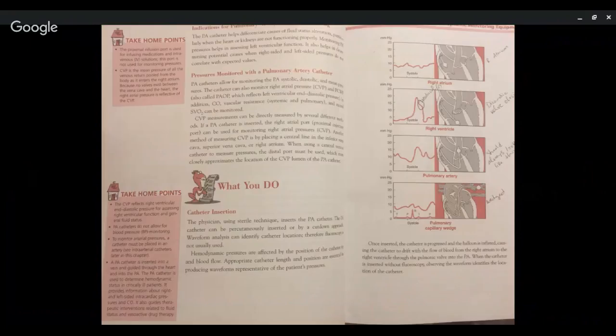The catheter can also monitor right atrial pressure, CVP, and pulmonary capillary wedge pressure, also called PAOP, occlusion pressure, which reflects left ventricular end diastolic pressure. In addition, cardiac output, vascular resistance, systemic and pulmonary, and mixed SvO2 can be monitored.